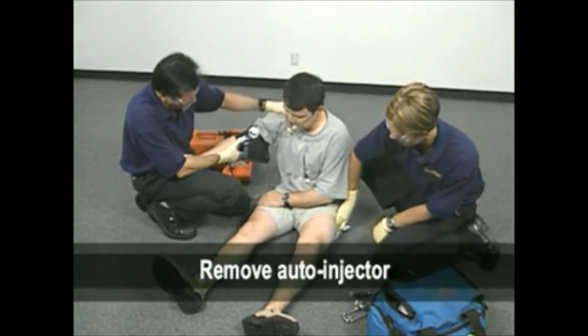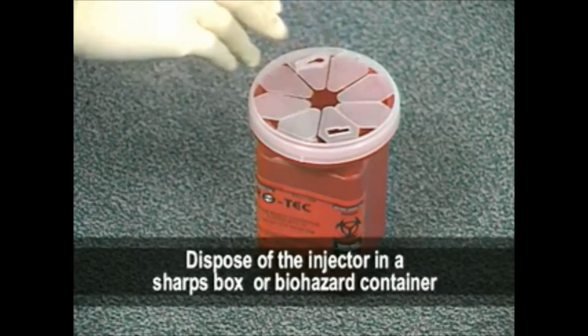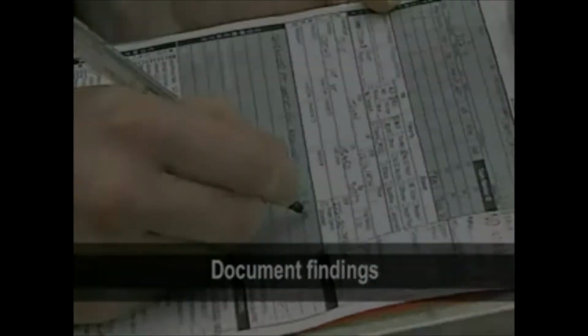Remove auto-injector. Dispose of the injector in a sharps box or biohazard container. Document your findings.